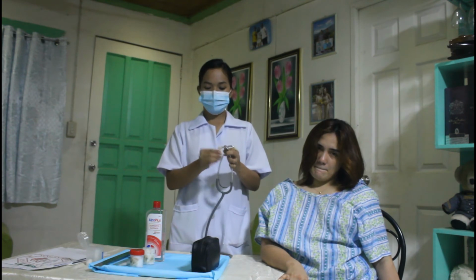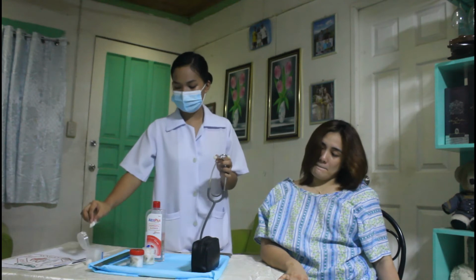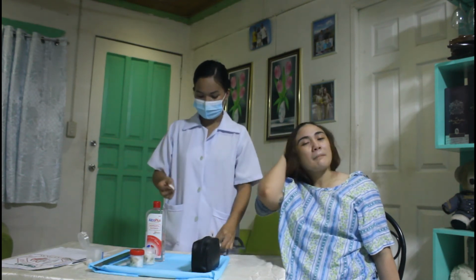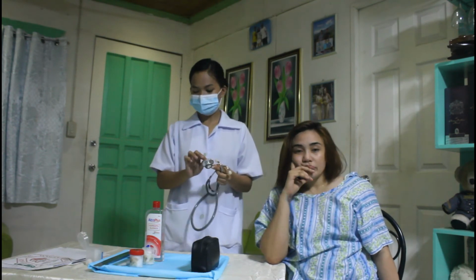So, one for this earpiece and then one for the other side, and then of course one for the diaphragm of the stethoscope. So this will prevent transmission of microorganisms and promote asepsis.